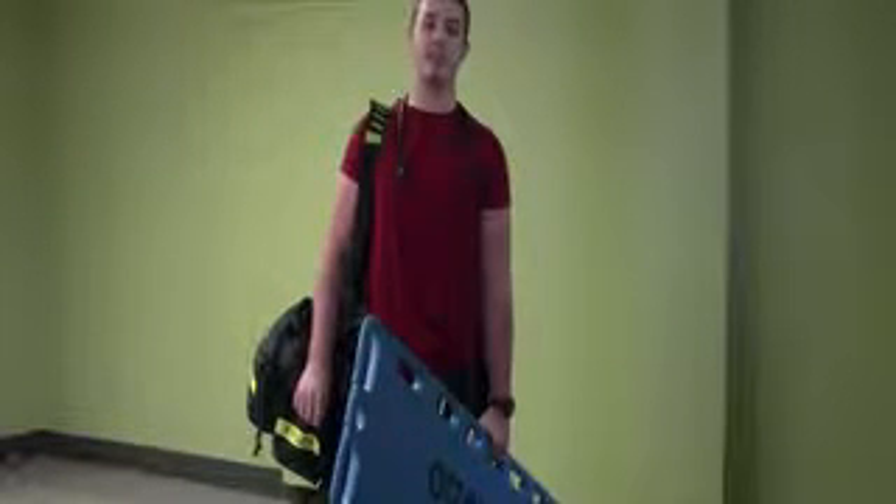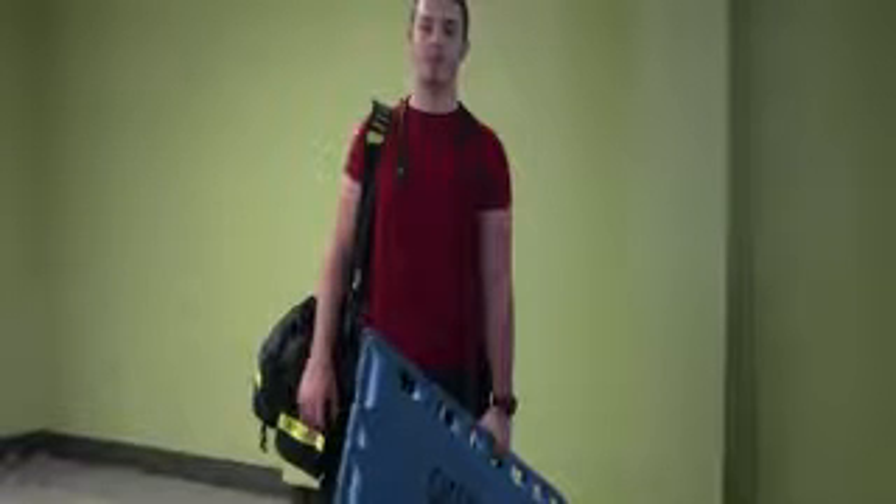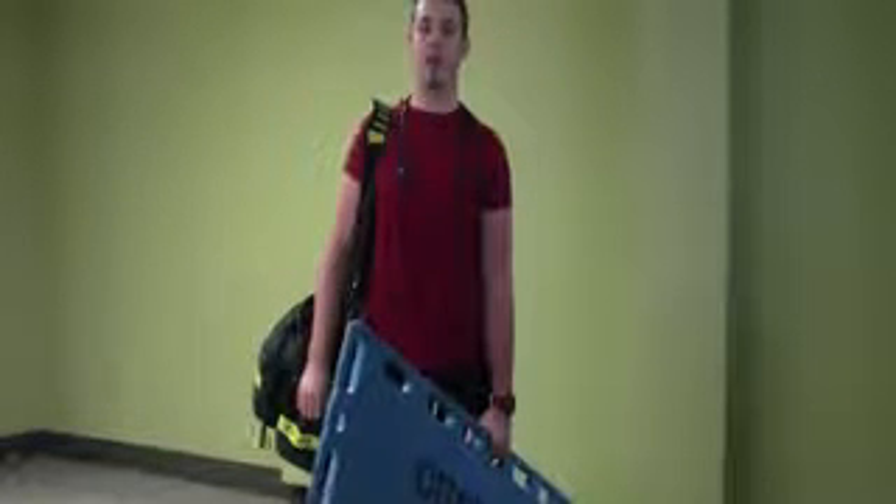Hi, my name is Daniel, and I'm a paramedic student at SLC. Today, I will be showing you how to properly and safely hold C-spine and fully immobilize a patient.